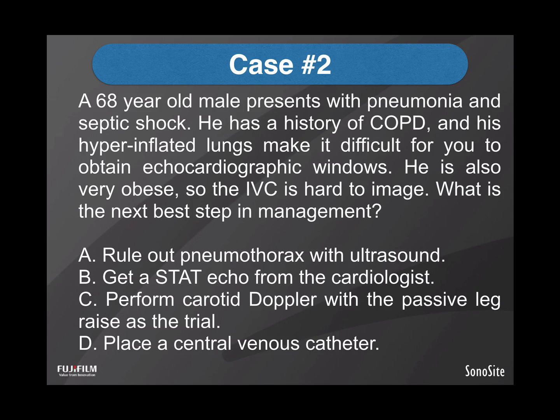Because he has COPD, his lungs are really hyperinflated and it makes it difficult for you to obtain echocardiographic views. And he's also pretty obese, so the IVC is hard to image as well. So what is your next best step in management?